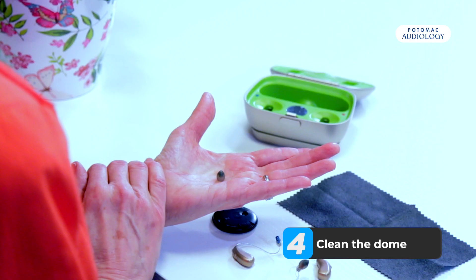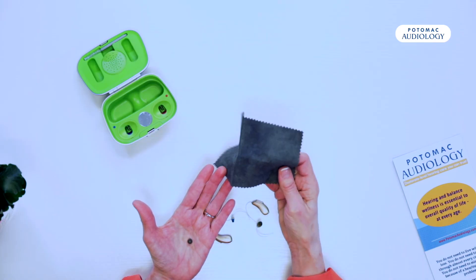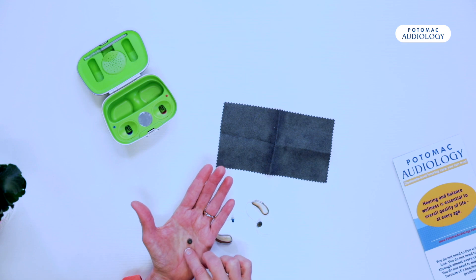The dome can be cleaned generally speaking by either wiping it off with a damp cloth or a dry cloth, or you can put a little dot of soap in your hand, make a little bath, wash it off, dry it, and you can put it right back on.